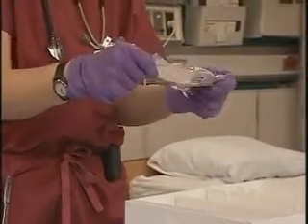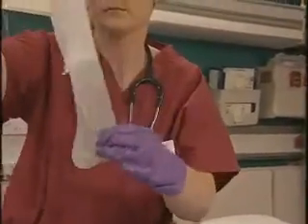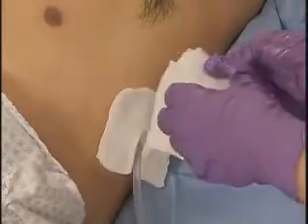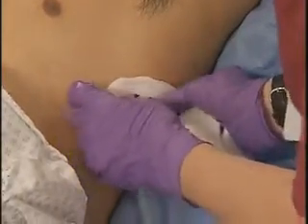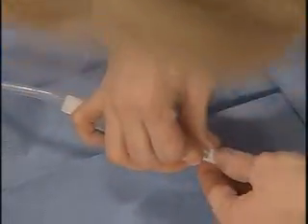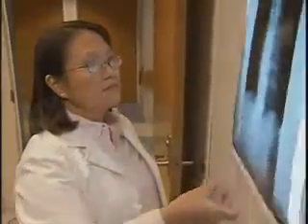After the physician sutures the chest tube in place, apply a dressing to the insertion site. If ordered, use petrolatum gauze to create an airtight seal around the tube. Then apply a dressing, such as fenestrated or split gauze, and 4x4 occlusive gauze, and tape the entire surface of the dressing. Secure all tube connections with tape or nylon bands to help prevent an air leak. As ordered, arrange for a chest X-ray to confirm tube placement in the patient's pleural space.